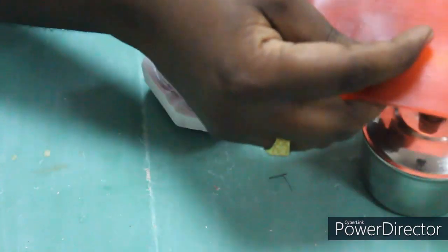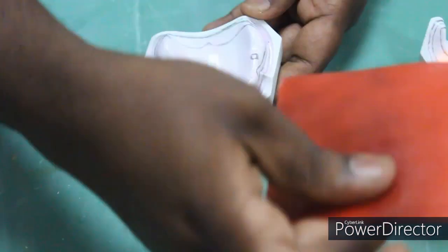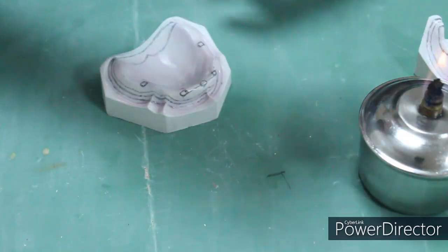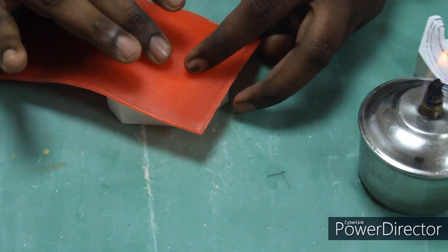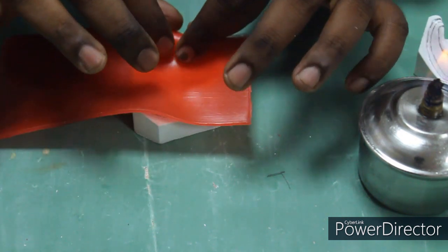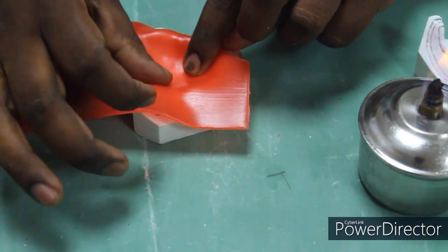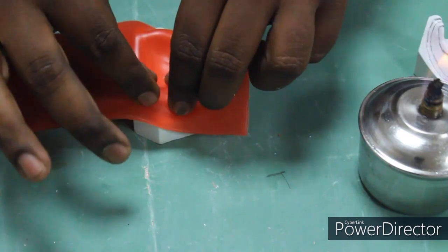Once it becomes softened, it will sag, and now you can see the sagging of this wax. At this time you have to apply it on this cast and adapt it onto the ridges of the maxillary cast.